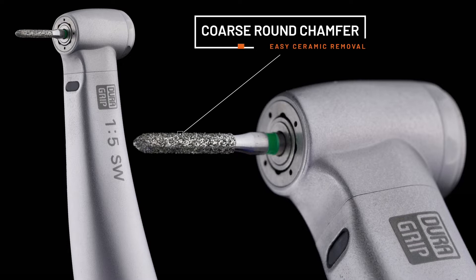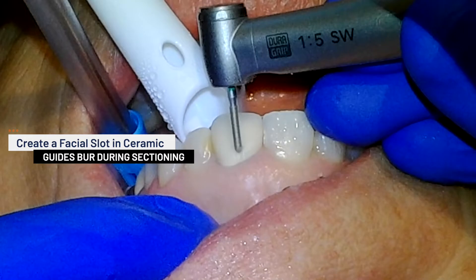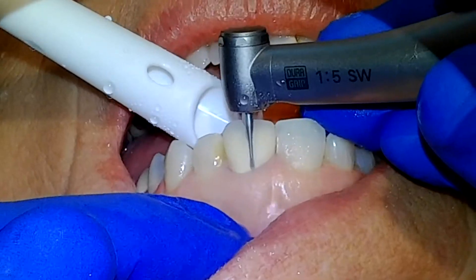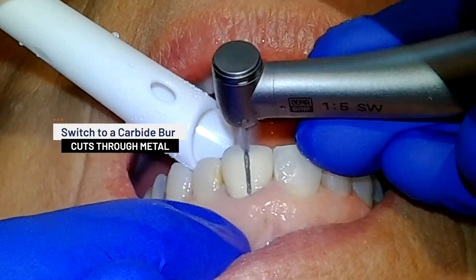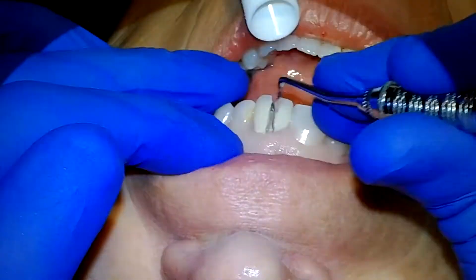I always find it helpful to start with a coarse round chamfer burr to begin my preparations. Whenever I begin sectioning a crown, I always start by creating a slot or trough on the facial surface of the ceramic to help guide the burr. You will get the best results if you avoid pressing too hard and just let the burr do the cutting for you. Once you have cut through the ceramic, switch to a carbide burr to easily section through the metal substructure. Light pressure with a crown remover will then allow easy removal of the restoration.